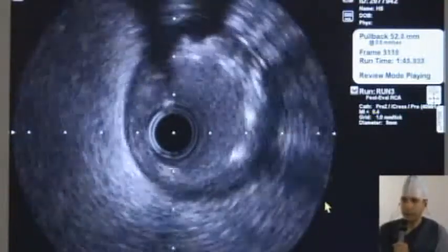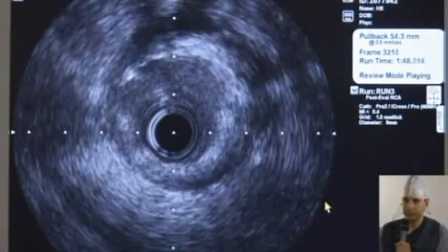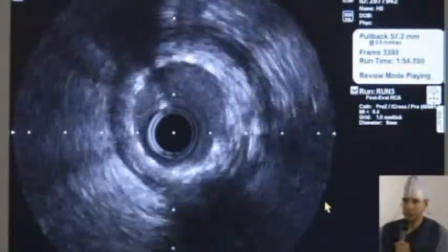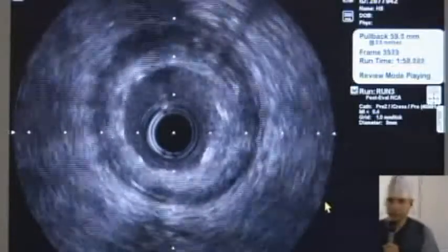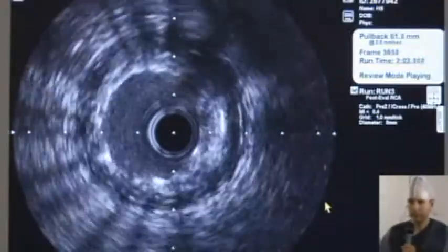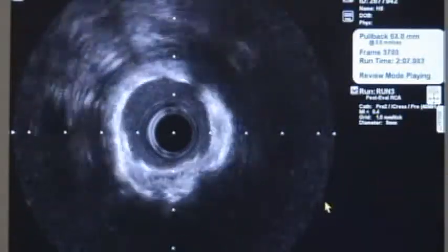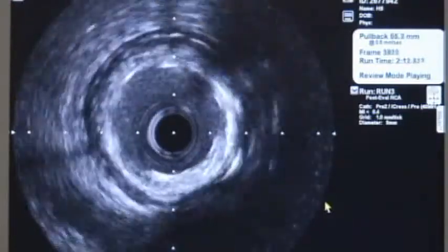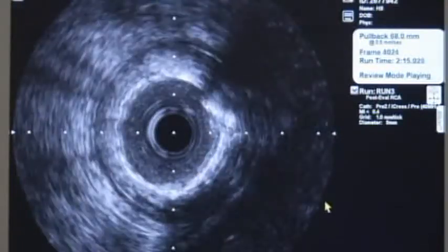I think the question, maybe I'll ask Adriana: end of the stent. Spot stenting versus full metal jacket. Where do you decide to go for full metal jacket or spot stenting? Because there was a chance to do spot stenting here, even if the other lesions were significant. I think that was a good approach. I like it. I think we have to cover most of the lesion. So I think we have a good result. So you would go for full metal jacket, right? Full metal jacket. How about Arimandiu?